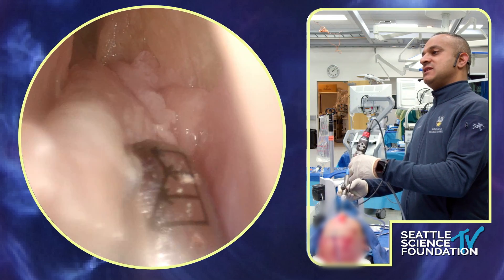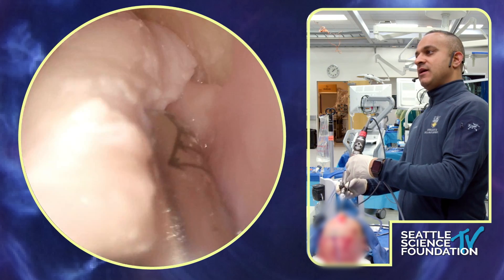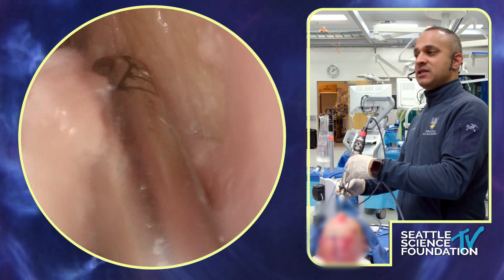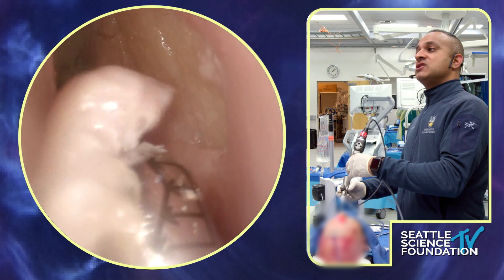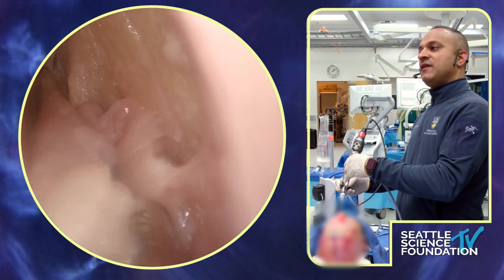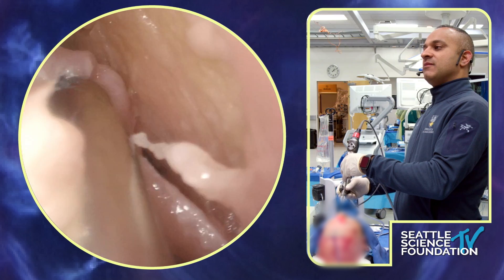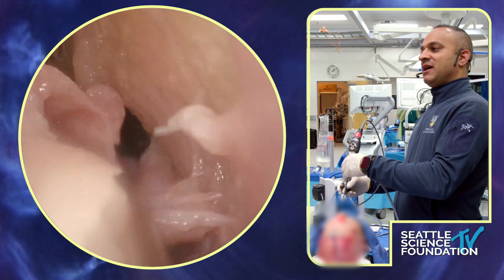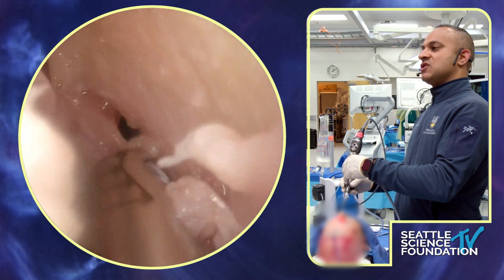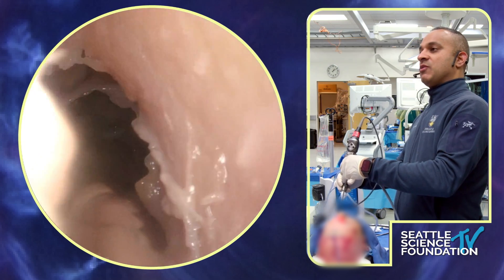The septal swell body is so thick it can frequently plug your microdebriter, so just be cautious of that. You can leave the flaps attached and use them to reline the posterior table — I saw Jim show me his flaps like that. You can also use the lateral nasal wall flaps inferiorly based; I saw Brad Woodworth show me that at this course a couple of years ago. In my hands, I just put them up the microdebriter, because the incidence of them getting wrapped up in what I'm drilling later is so high that if you're learning this procedure it's better to just approach it that way.